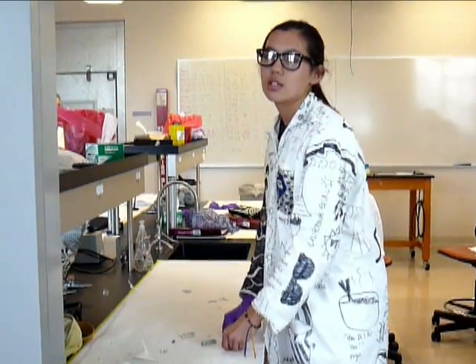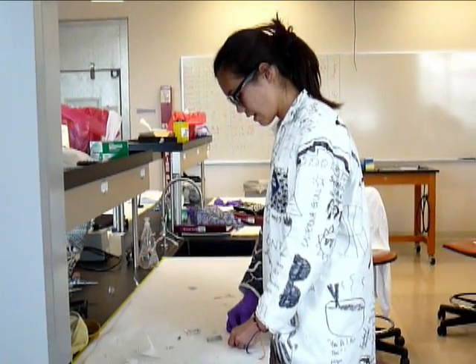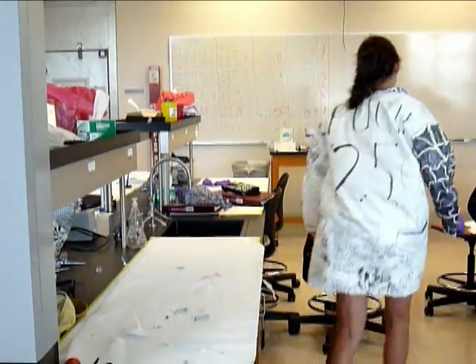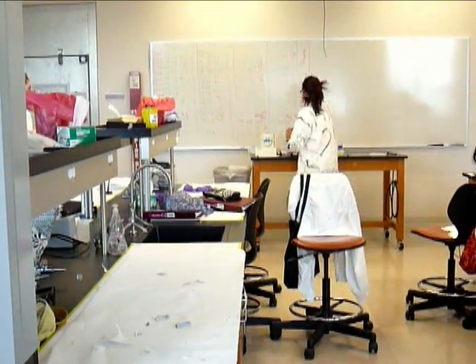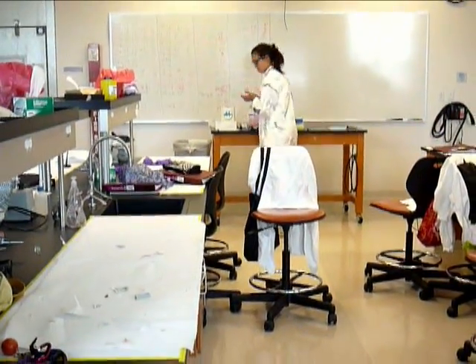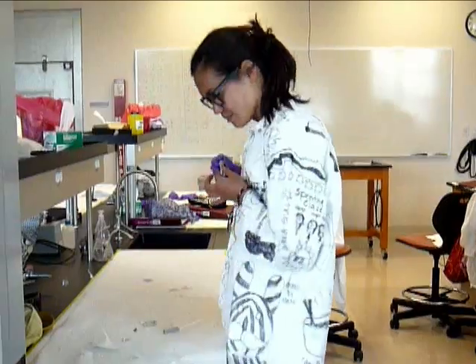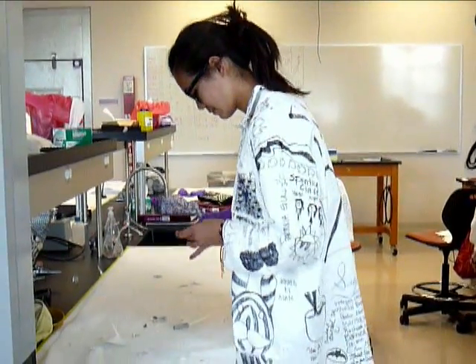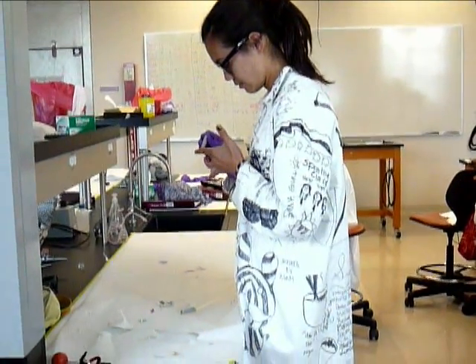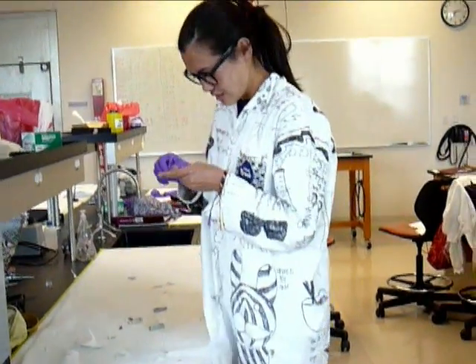And then it's always unfortunate if you don't get enough blood, that you have to do it again, which looks like I might have to. So, let's do it back. I'm just kidding, that doesn't hurt. Perfect.